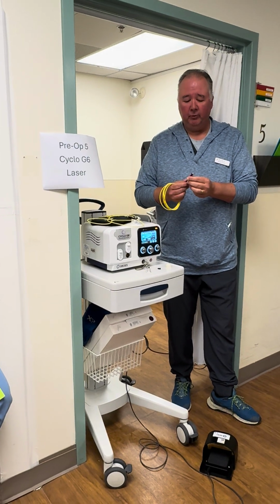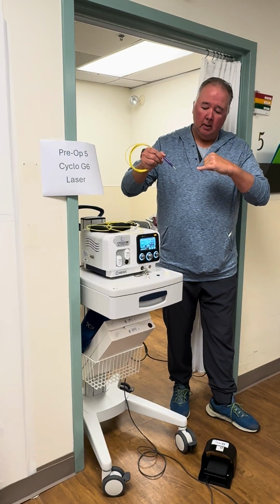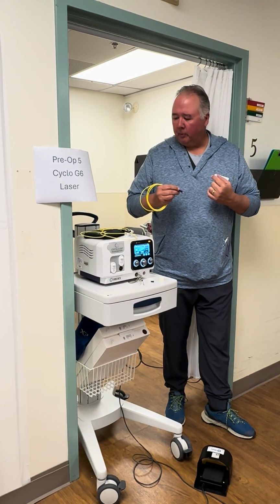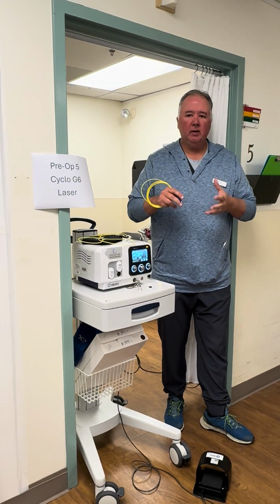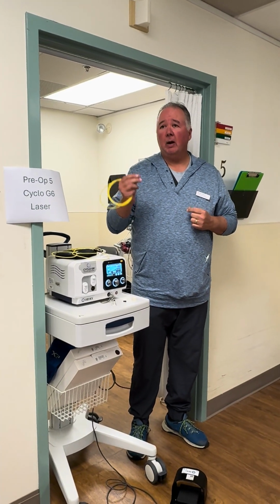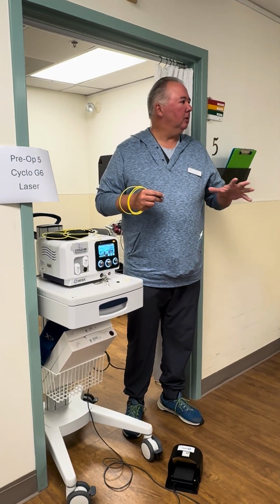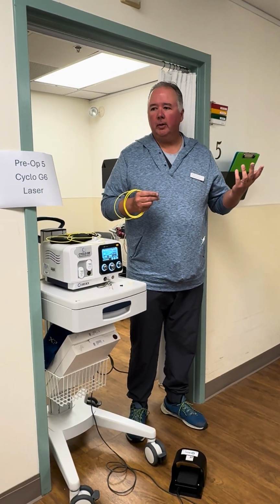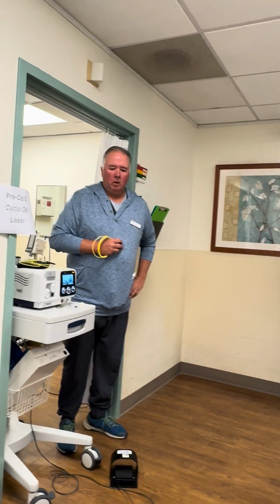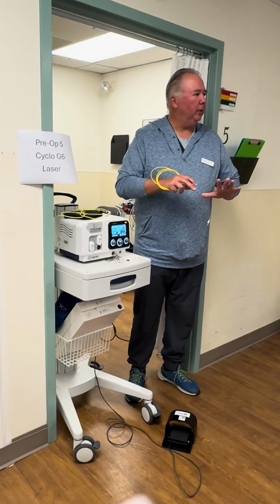The laser energy is focused towards pigment in the eye. So if there's betadine and it's on the surface, the energy is going to penetrate the pigment and not necessarily the structure of the eye that it's after. So that's one thing. The other thing too is if the patient comes in and they've got a pretty red, angry eye, the laser energy is going to focus probably on the blood vessels and not necessarily the structure of the eye. So whatever the doctor has for protocol, sometimes they'll put phenylephrine on there to reduce the blood vessels, at least where they're going to treat anyway.